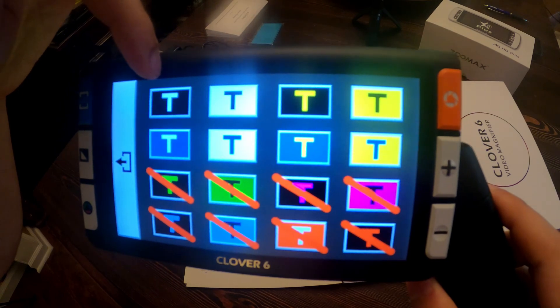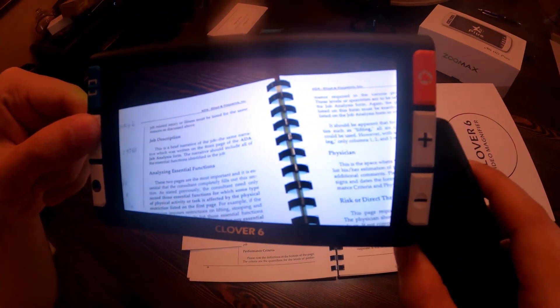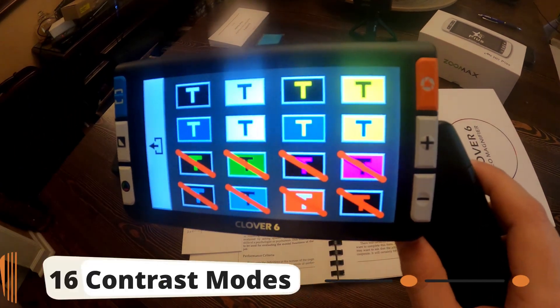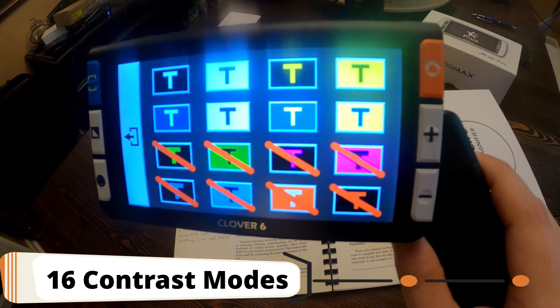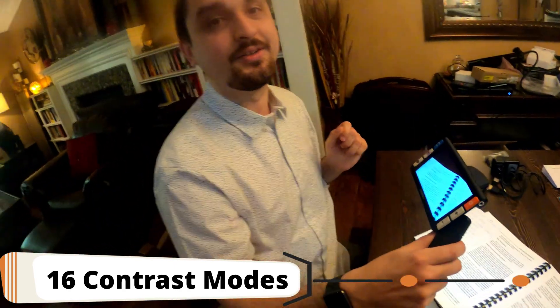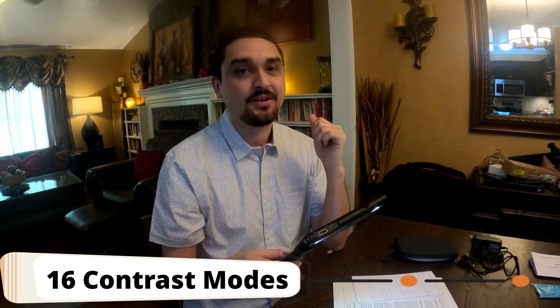So we can see we have normal, we have a dark mode. You can just go through a few of them — we have yellow and black, both variations of that, white and blue, blue and yellow, green and black, looks like a purple and black, and a few others. So you have most of the contrast modes. I think their website says there are 16 contrast settings.